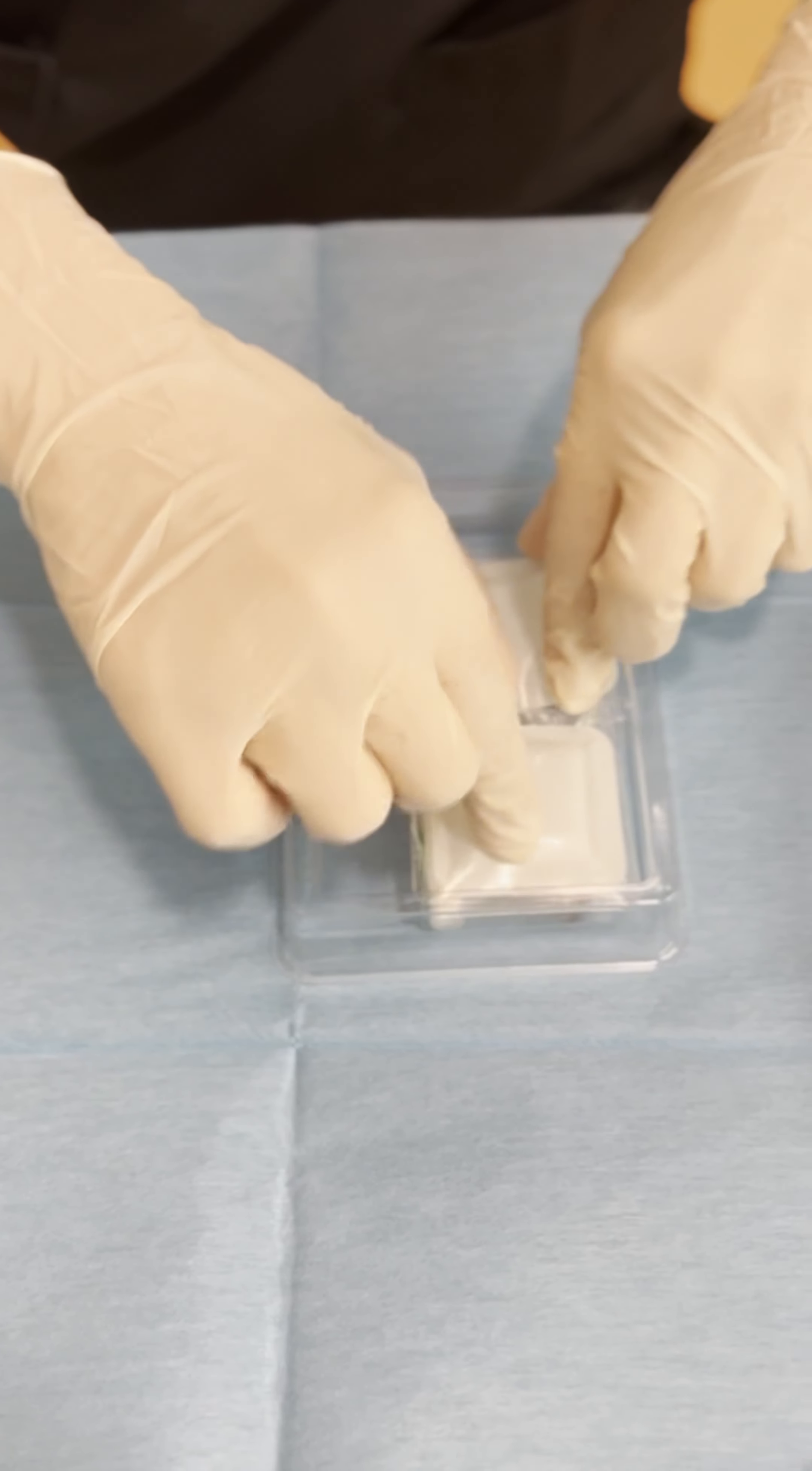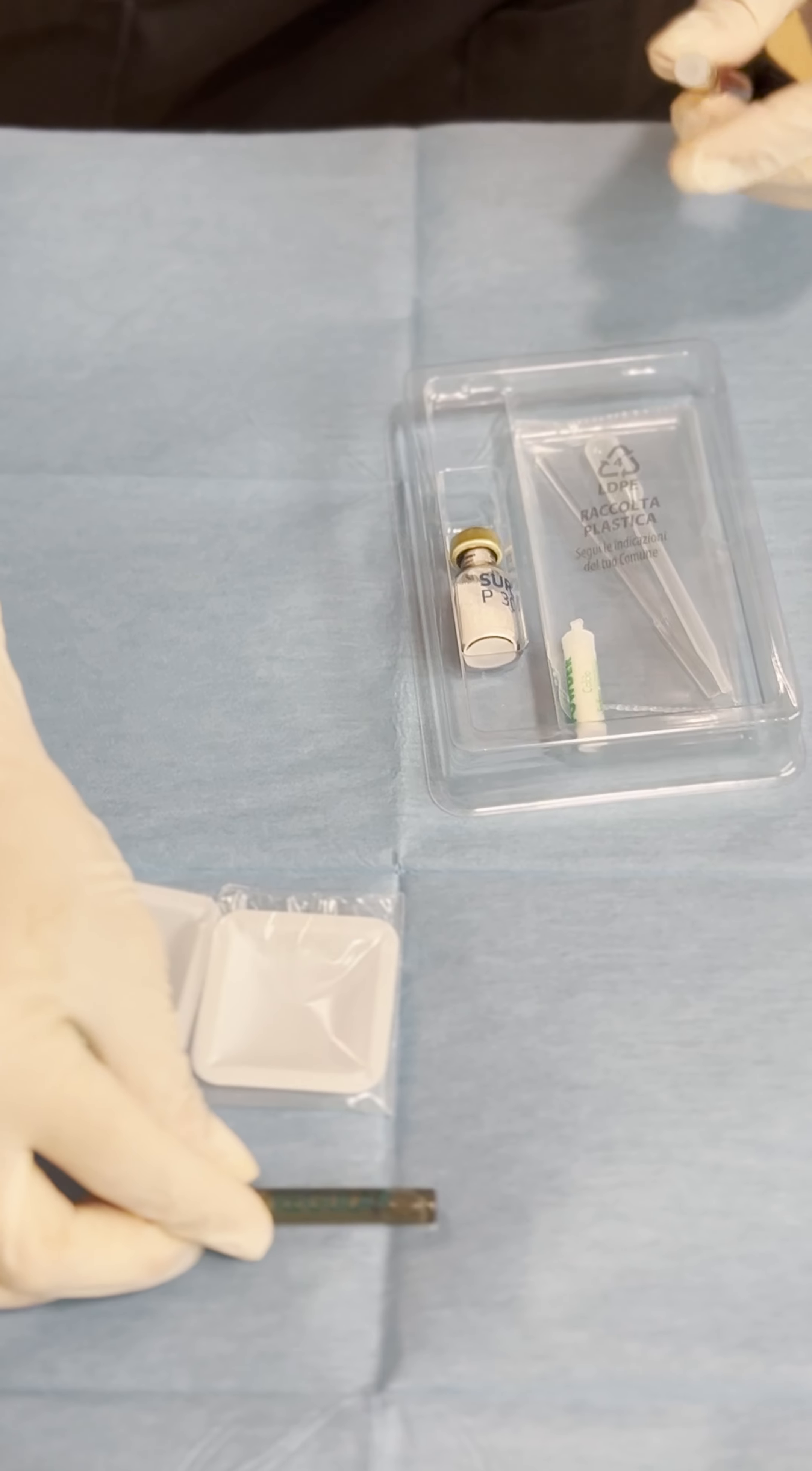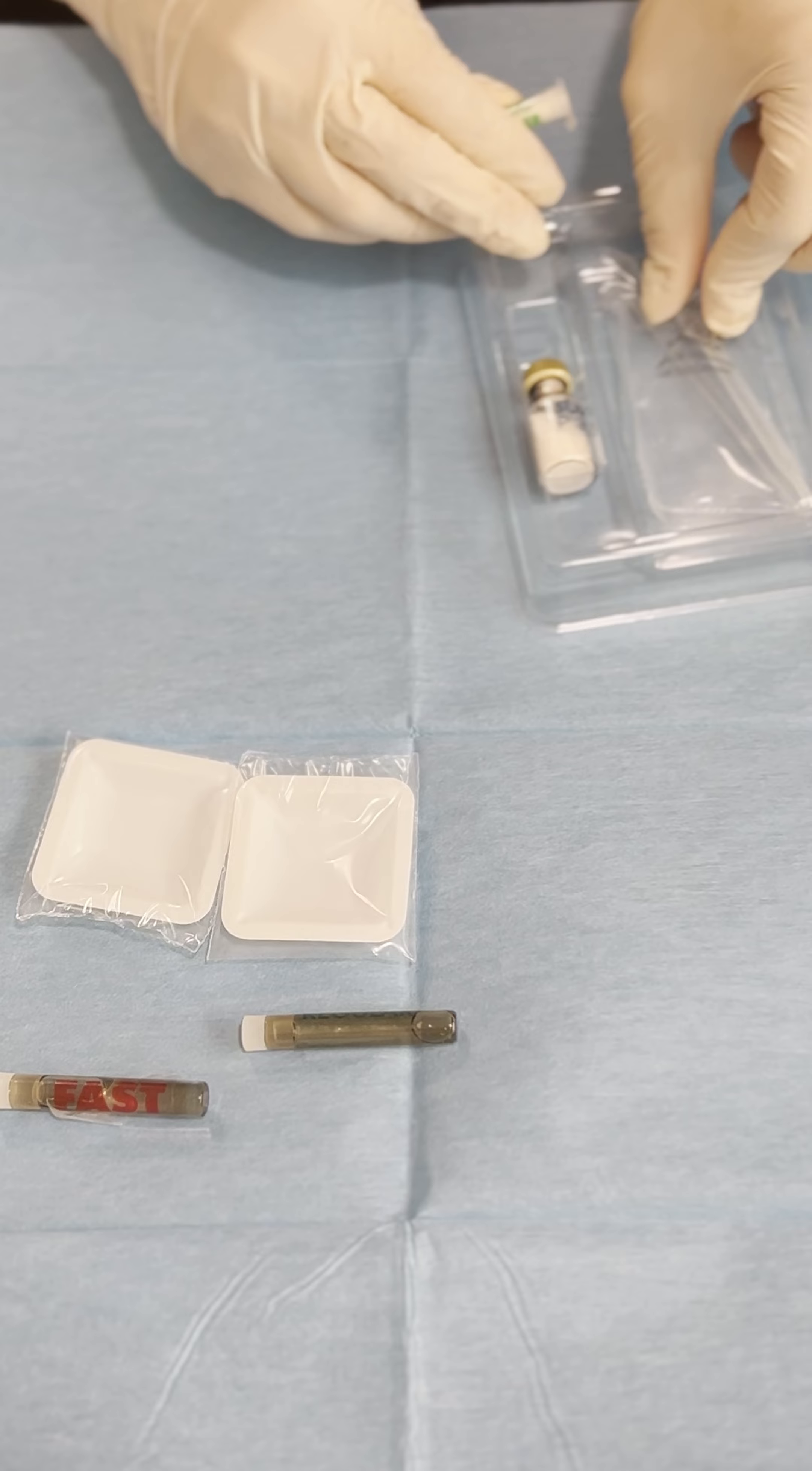In the inside we find two dappins so we can mix it and these are sterile. We are going to find a regular vial which is basically a physiological solution and the fast liquid which is potassium ions that helps speed up the hardening process of the biomaterial.